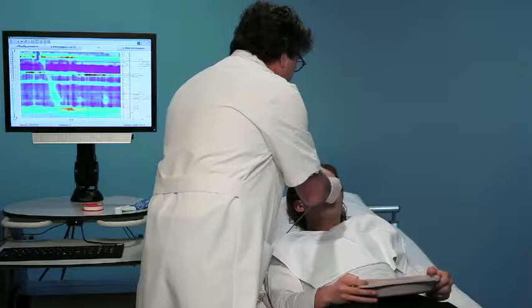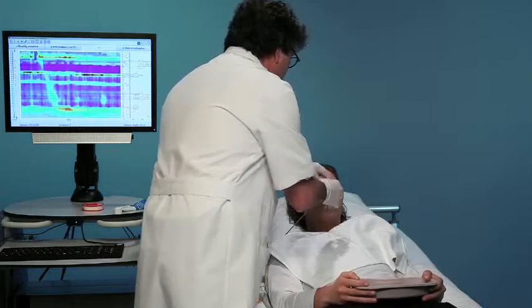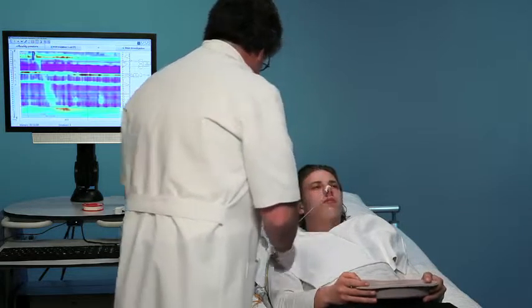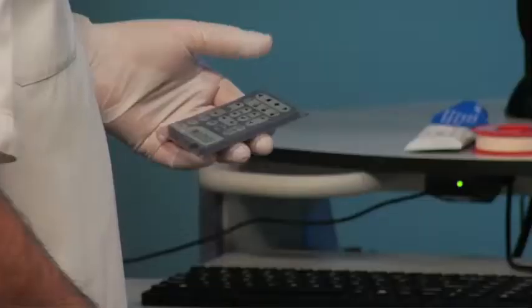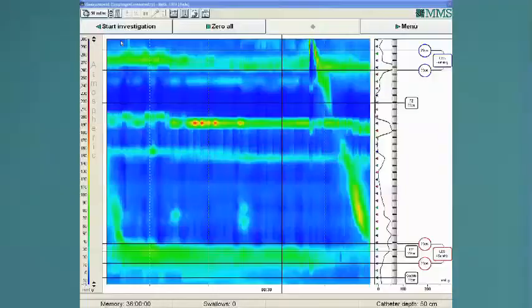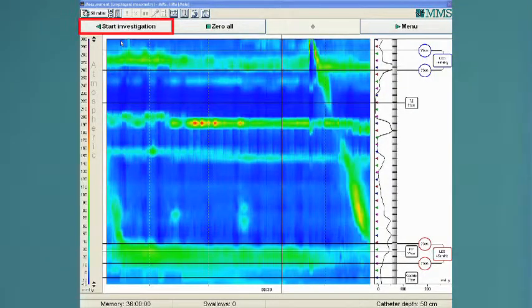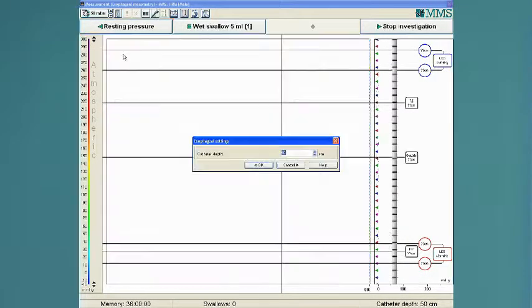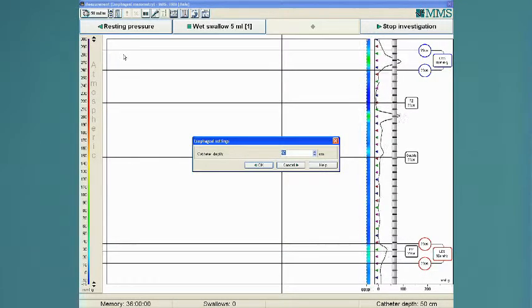When the catheter is in position, fix it to the nose. Start the examination. Enter the insertion depth of the catheter.